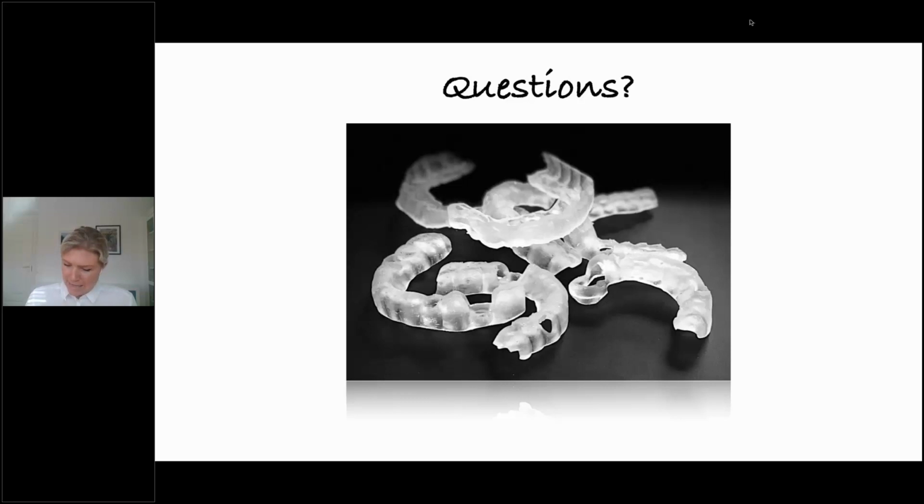Okay, thank you, Zach. And another question that we had was, which step do you think is the most complicated one in the digital implant workflow? For me, speaking as a periodontist, it's doing the wax ups. It's the restorative design. Now, those of you who are practicing CAD/CAM dentistry, it's going to be the opposite, right?